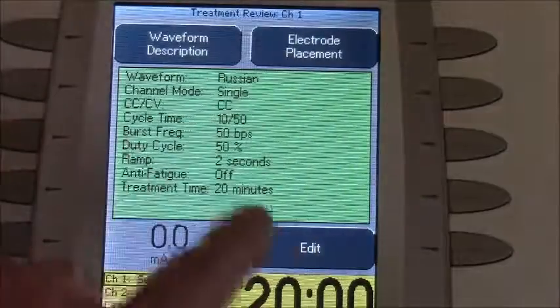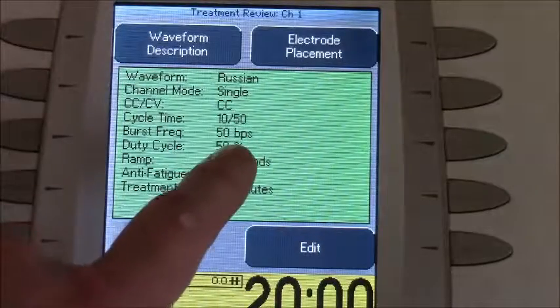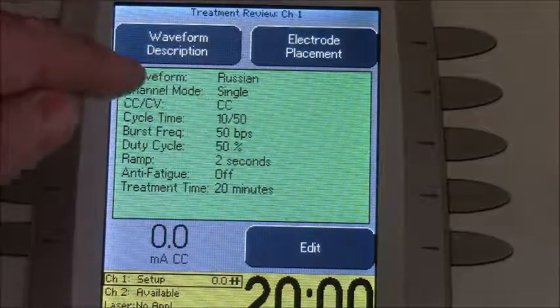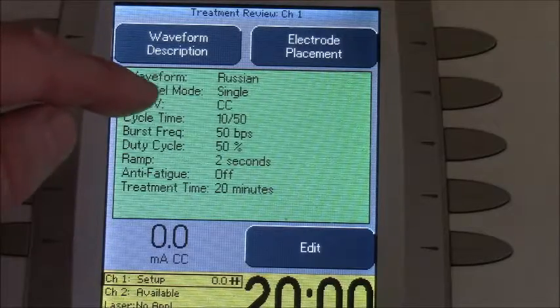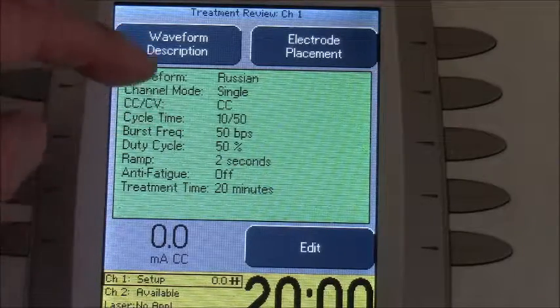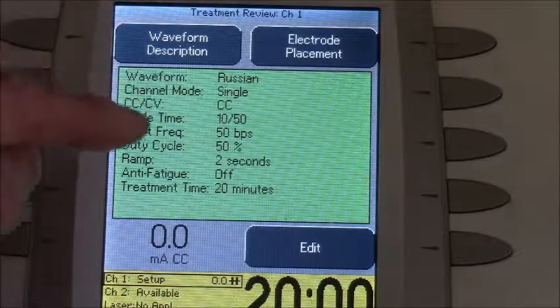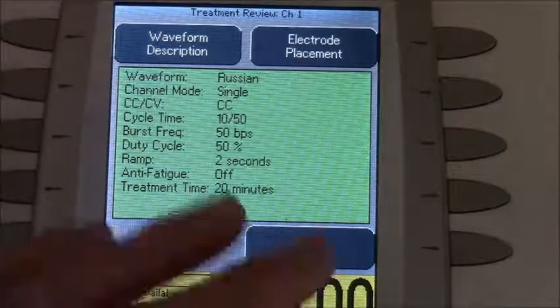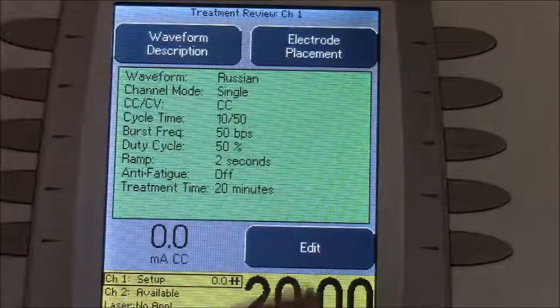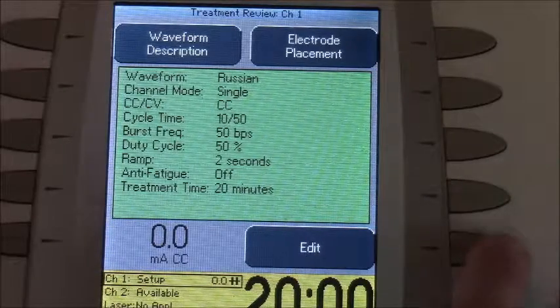Just a quick note: when you look at this green screen it shows you all the parameters — the channel mode, constant current, constant voltage, cycle time, burst frequency, and so on. That helps to identify what the set of parameters are for a specific desired outcome.